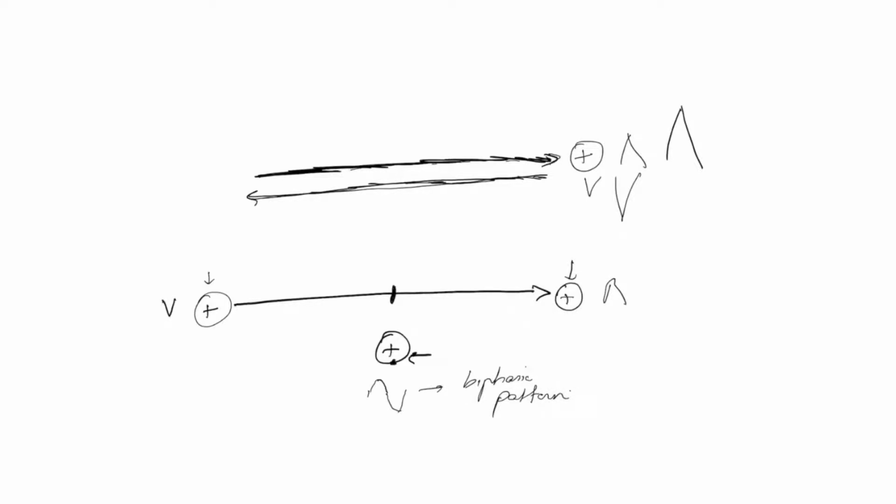Now, we talked about earlier that depolarization and repolarization are opposite phenomena. So let's say there's a wave of repolarization now going this way. Which way do you think the leads would record the impulse? Well, this specific lead would now have a negative wave because it's a wave of repolarization, and that's the opposite of depolarization. This lead would have a positive deflection, and this lead would record a negative wave followed by a positive wave.